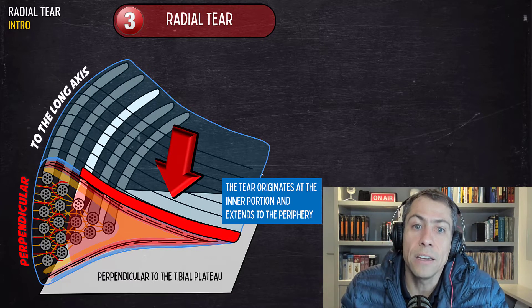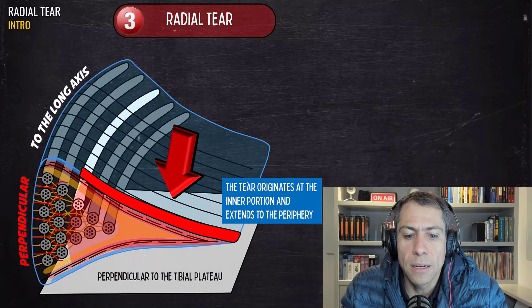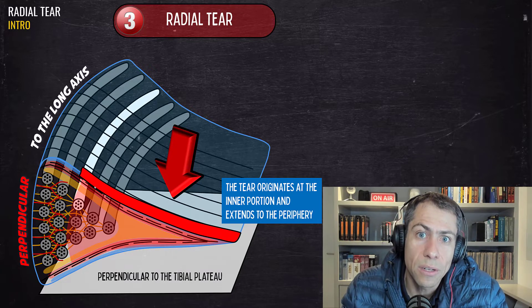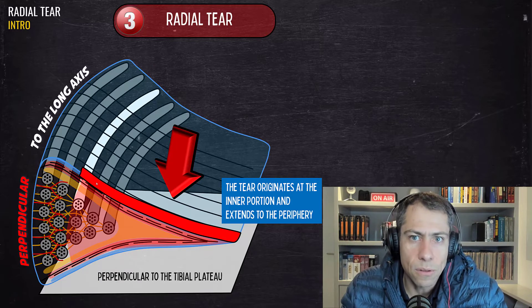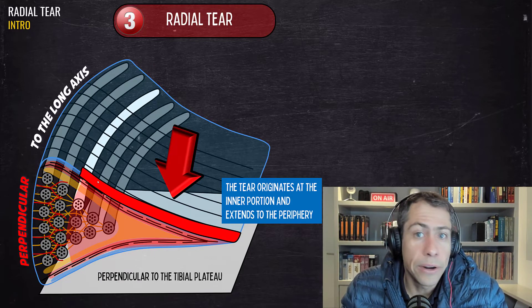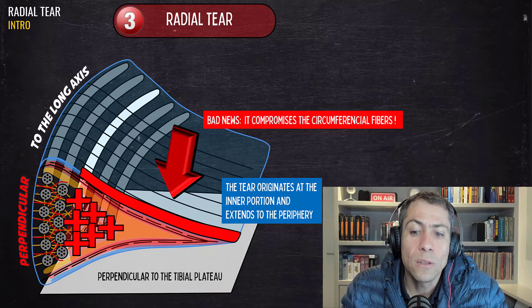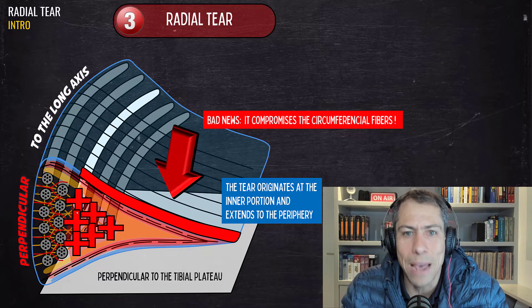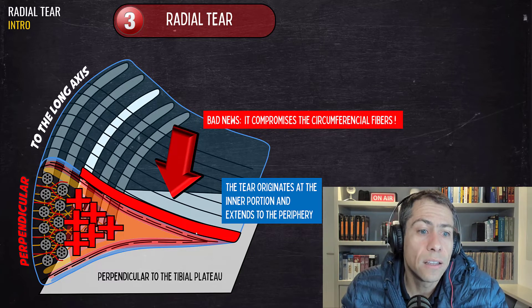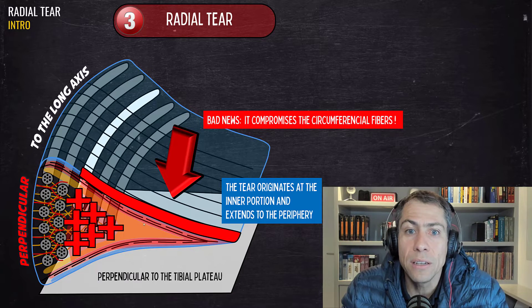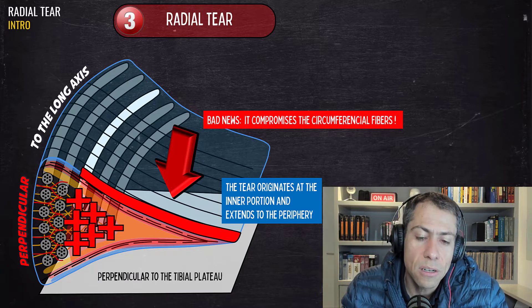The radial tear originates at the inner portion of the meniscus and extends to the periphery. The bad news is that it compromises the circumferential fibers, which is particularly damaging — especially when the tear is large enough, when it is a complete radial tear, or when it extends all the way to the periphery of the meniscus.